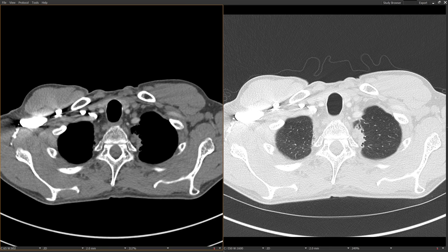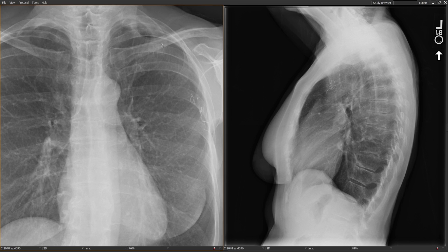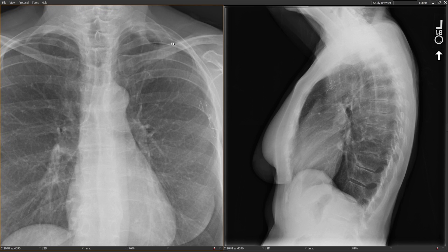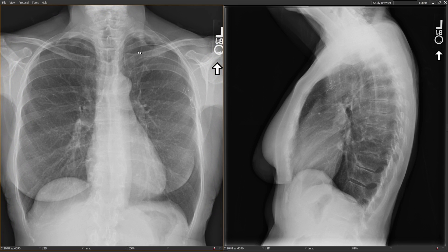Now let's take a look at some patients with breast radiation. This patient has had breast cancer, and there are a couple of findings that tell us she has had treatment: surgical clips in the left chest wall axillary region, and the left breast is slightly smaller than the right due to surgery. The chest X-ray was read as an asymmetric opacity in the left apex, and a chest CT was recommended — you can see a hazy opacity at the left apex that's a little more dense compared to the other side.